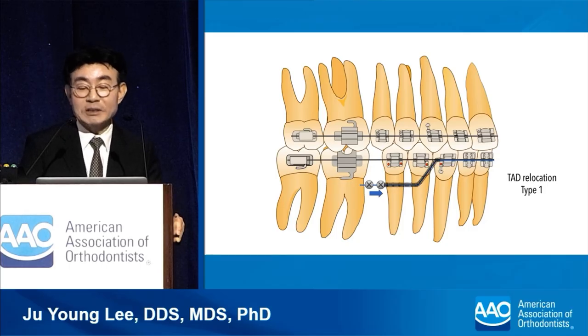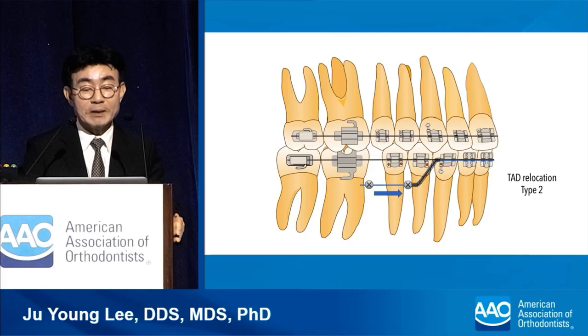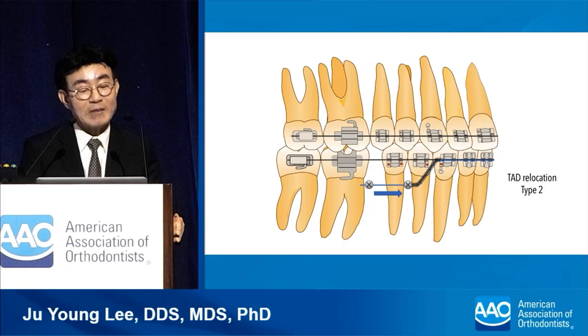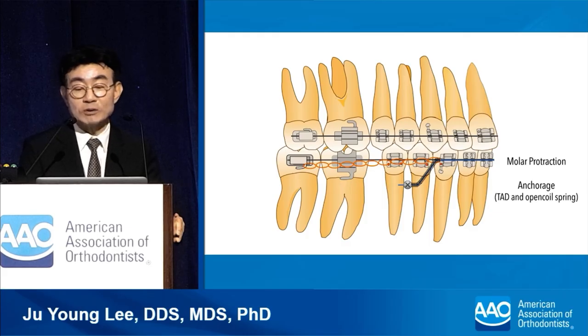If the TAD interferes with the movement of the posterior teeth, the TAD should be repositioned anteriorly. At this time, it can be moved just behind the premolar. Alternatively, it may be installed between the roots of premolars that have already been moved to the desired position. After using the open coil spring to firmly hold the canine to the repositioned TAD, the posterior teeth are moved forward.